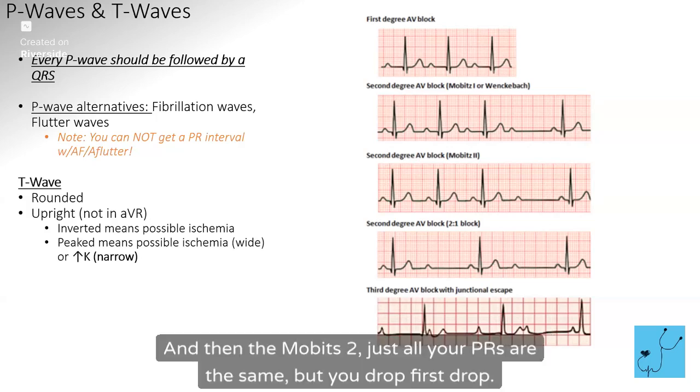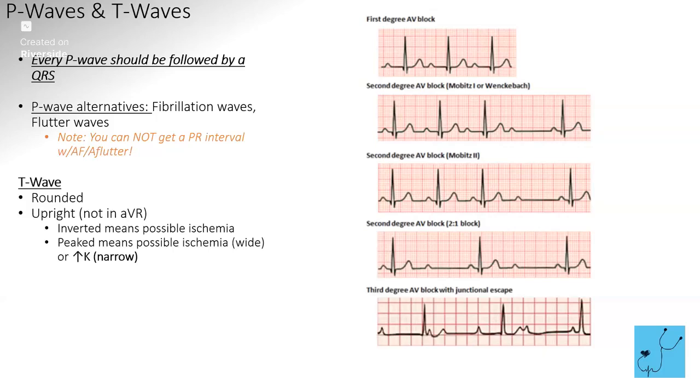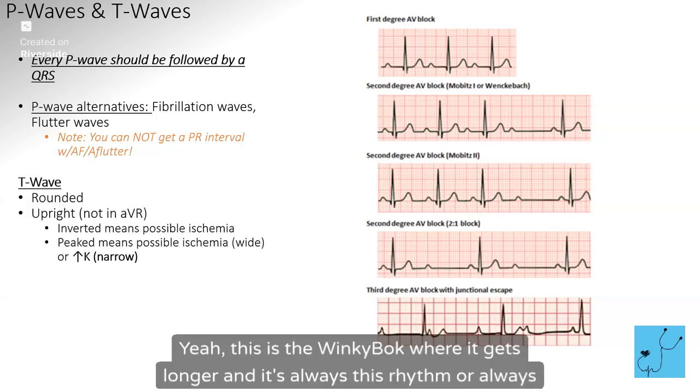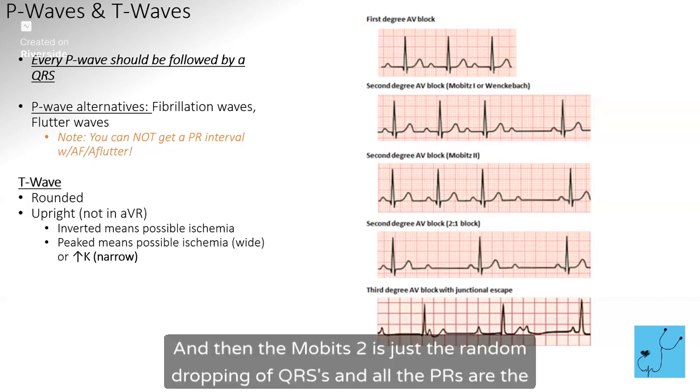And then the Mobitz 2, all your PRs are the same, but you first drop. This actually looks like the Wenckebach here. I think this is first degree, huh? The first degree block is just a prolonged PR. Yeah, this is the Wenckebach where it gets longer, and it's always this pattern. Longer, longer, longer, drop. And then the Mobitz 2 is just the random dropping of QRSs, and all the PRs are the same.